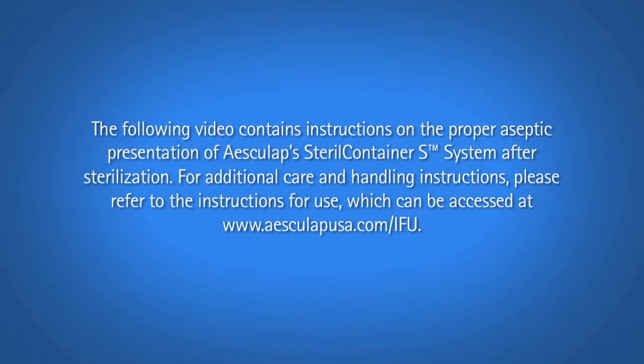The following video contains instructions on the proper aseptic presentation of Aesculap's SterilContainer S System after sterilization. For additional care and handling instructions, please refer to the instructions for use, which can be accessed at www.aesculapusa.com/IFU.